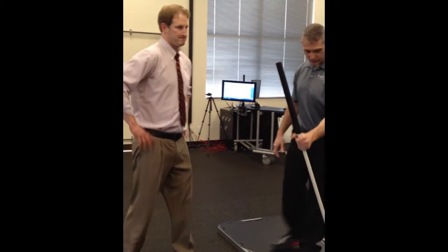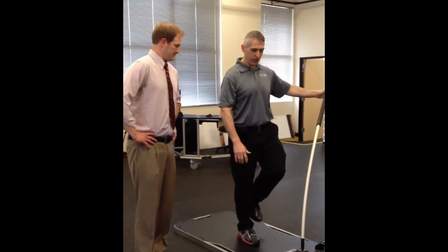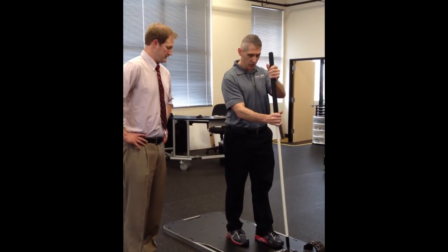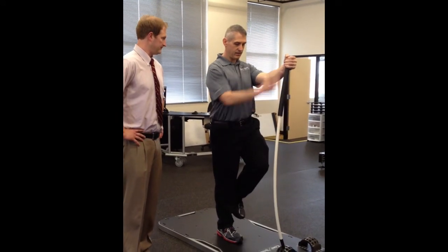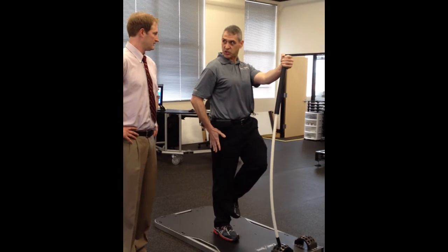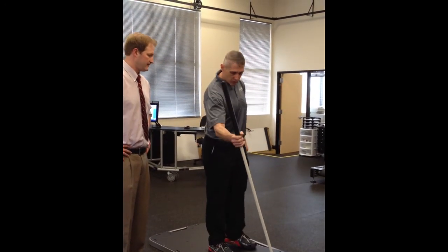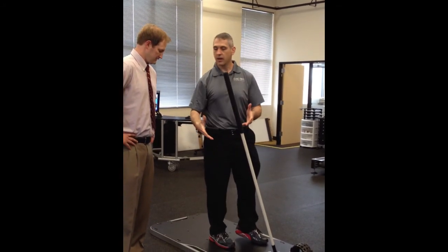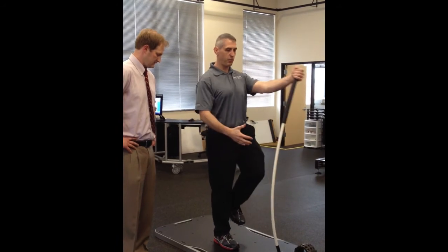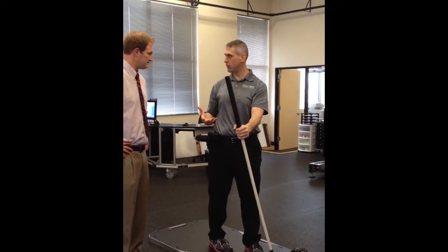Again, if you want to, you can do it from this position and it's going to be out further. Or you can do it from here, which aligns it to the finished position or where the body is. I find this is actually a lot more challenging, but it's out here — for some reason it's not nearly as much. You can also go cross-body this way — it's very similar. It just depends on what you're doing. I'll have people do it both ways, have them switch off or pull different.